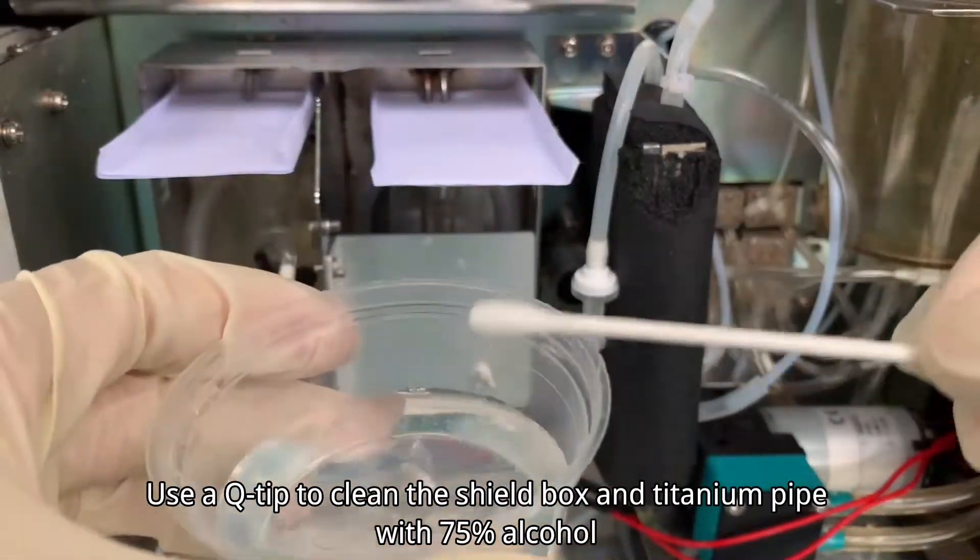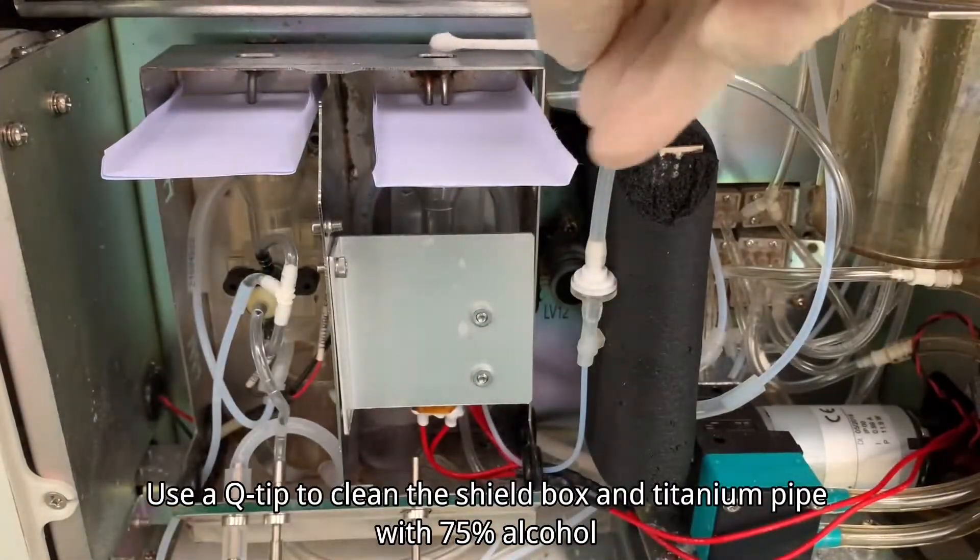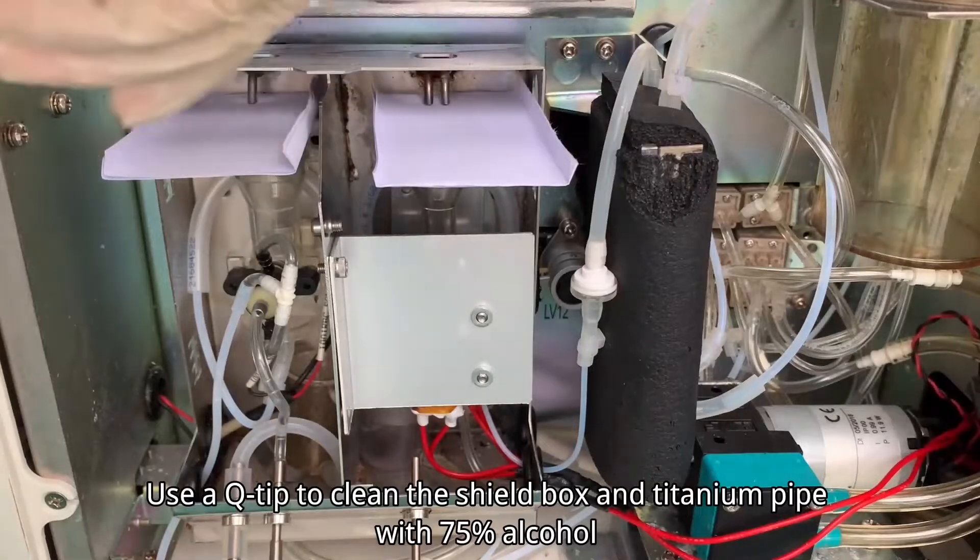Use a q-tip to clean the shield box and titanium pipe with 75% alcohol.